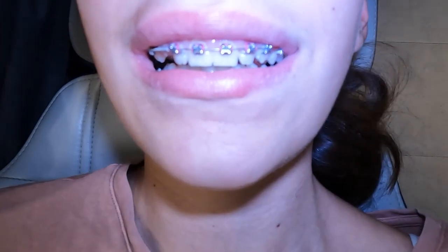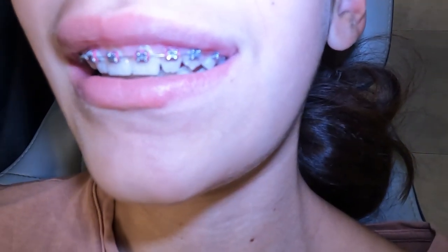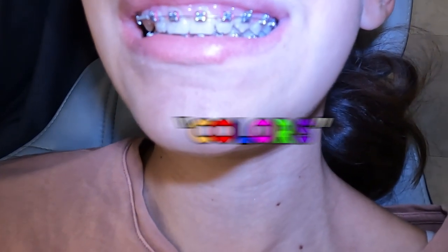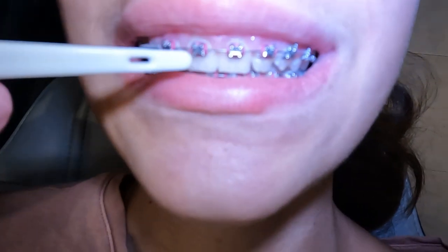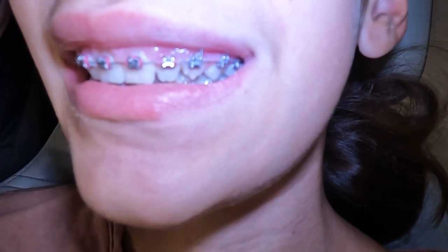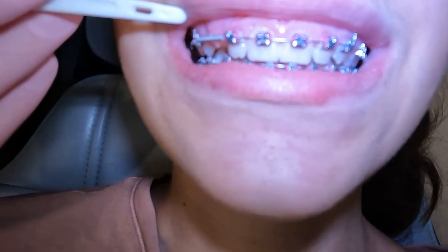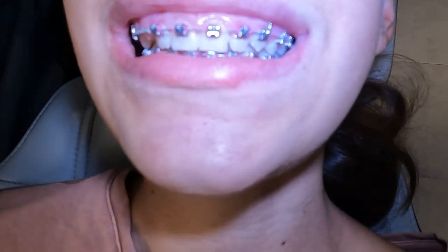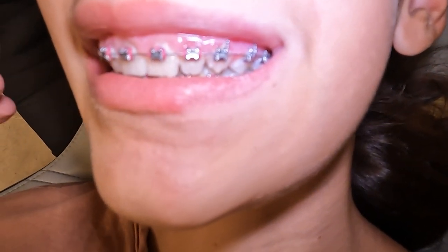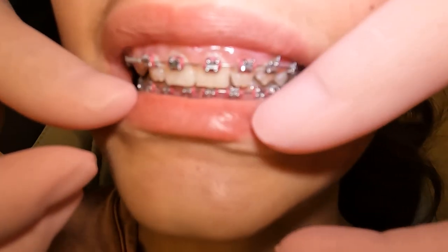Part of braces are brackets and wires, and depending on the type of brackets — how special they are — you may or may not absolutely need what we call colors. Those are the pink things that go around the brackets, and depending on the bracket, can help hold the wire in place. We have special brackets at our office. One thing to be aware of is that sometimes the power chain and these colors can make it hard to clean, so you have to be extra diligent trying to get above the brackets and remove extra material.